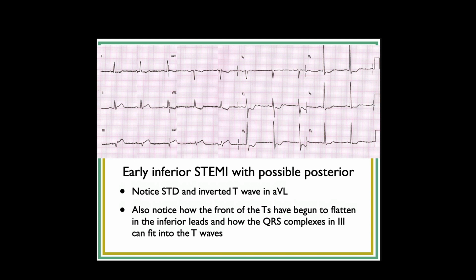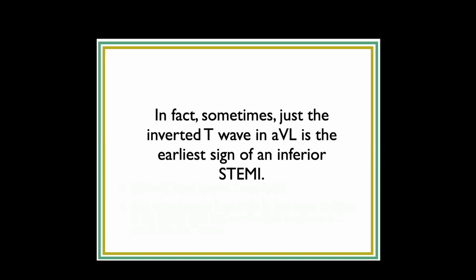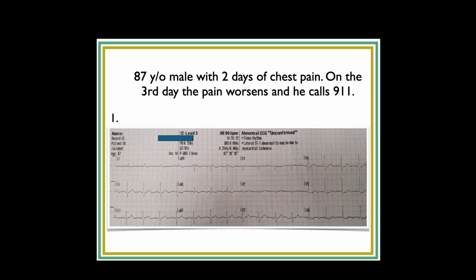But I think anybody who's just watched that little video of Dr. Matu is like, well, duh, of course it's an inferior STEMI, okay? So questions about this? We're going to keep talking about it a little bit, but let me stop here. Any questions? Okay. I'm going to give you another, this is sort of more the same. I like this one because it was a pre-hospital.